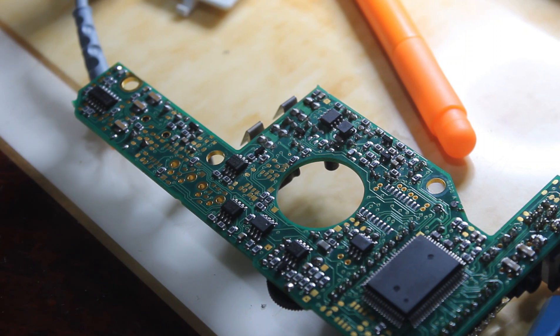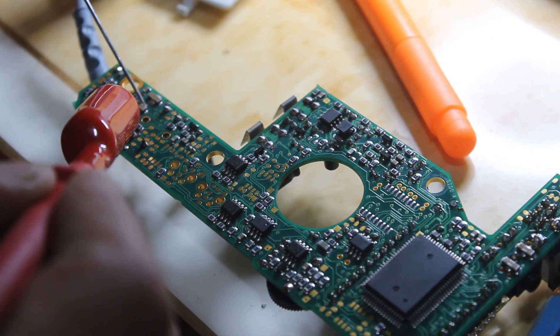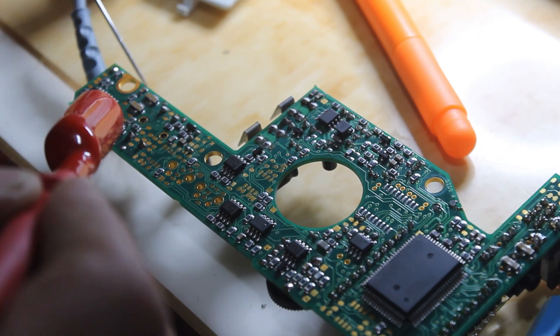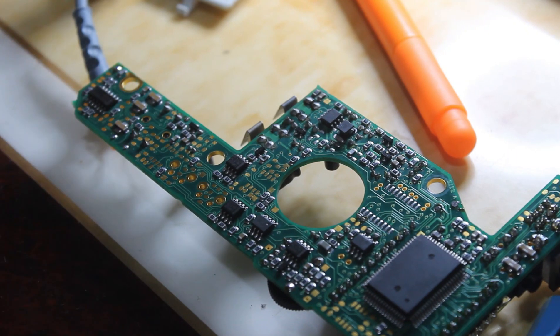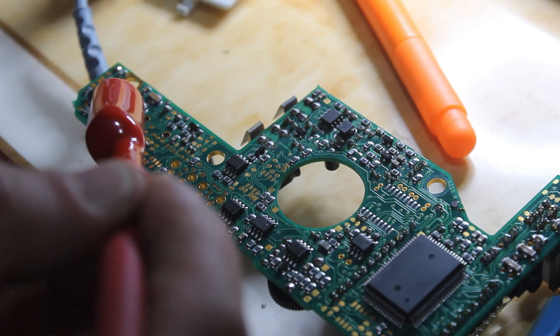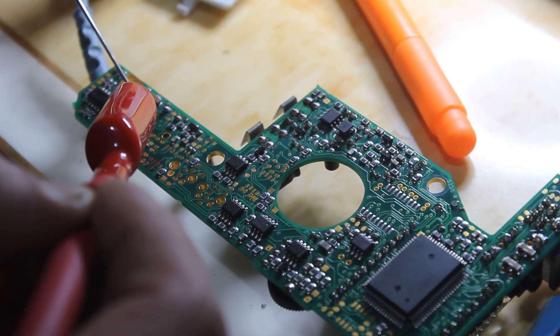Here, we have a short circuit on the board. We detected three capacitors that are shorting. I don't know which one is shorted — maybe all three, maybe just one of them. We need to order the small capacitors and then try again.